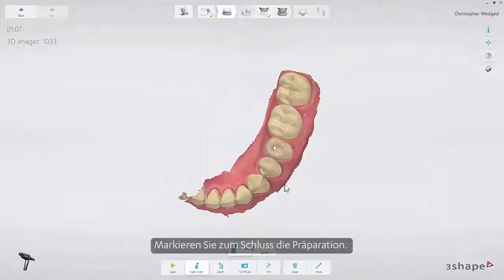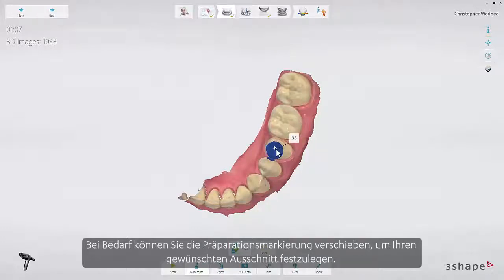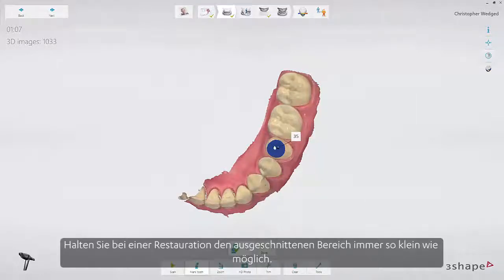Finally, mark the preparation. You will see a blue overlay around the preparation mark, indicating the area which will be automatically cut out when going to the scan body page. If necessary, you may reposition the prep mark to obtain your desired cutout. You may adjust the automatic cutout radius under Settings > Scan, or you may turn it off completely if you prefer to trim manually. Always use the smallest cutout area possible for a given restoration.